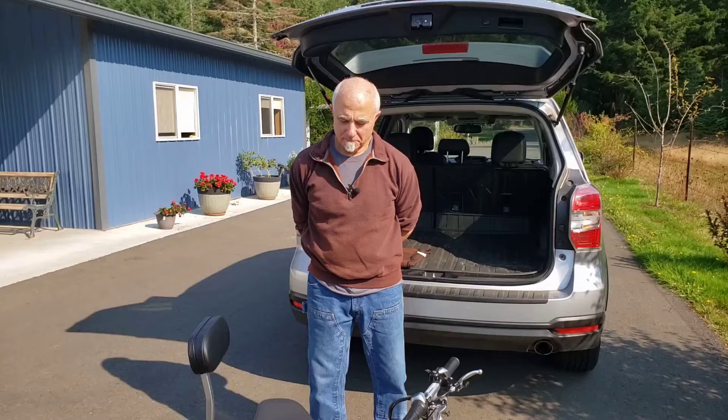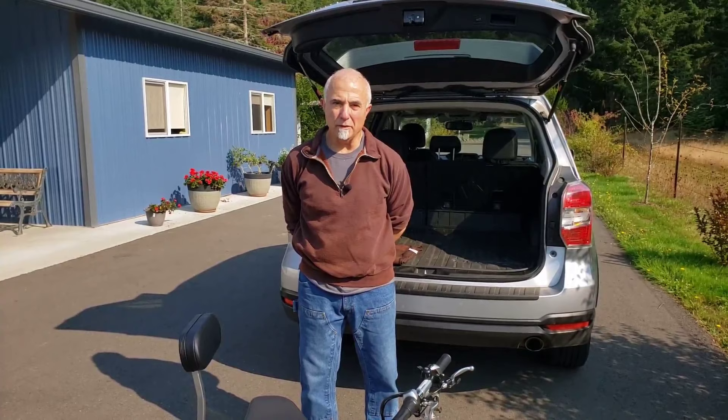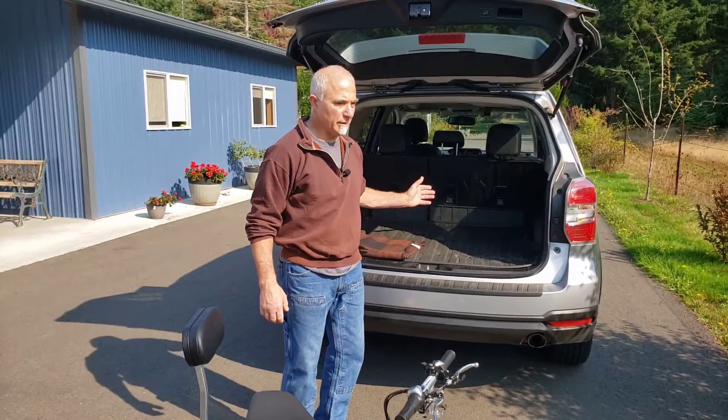Normally we get calls from people asking whether the TravelScoot will fit in their vehicle. With any other mobility scooter, they'd probably have to disclose what type of vehicle they have — but not so with the TravelScoot. It fits in any vehicle. We've got a Subaru Forester here. This is a slam dunk — a walk in the park, or a scoot in the park. It fits.